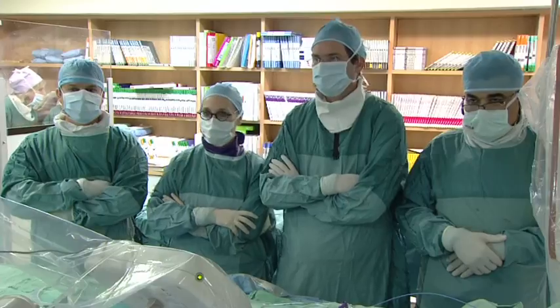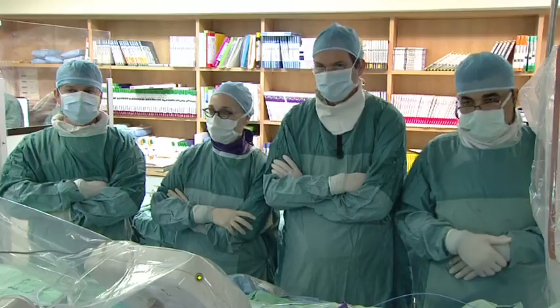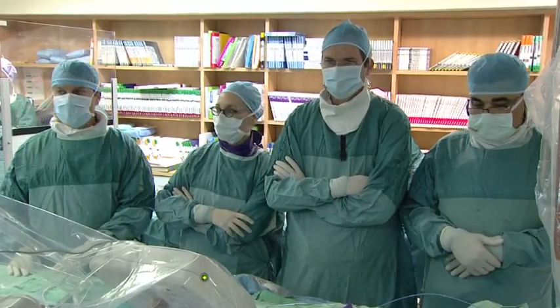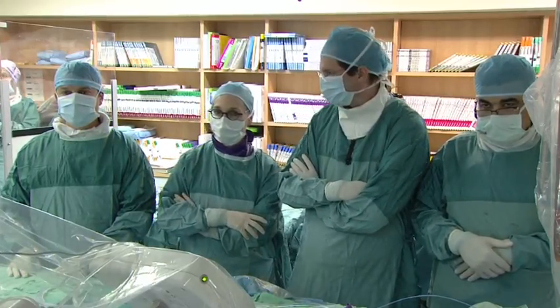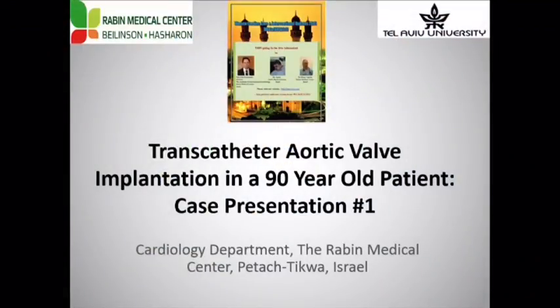The first patient that we would like to present is an elderly patient with critical aortic stenosis, and we are going to present to you how we perform a TAVI case, and I would like to ask Dr. Pearl to present the case. Thank you, Professor Kornowski. So the first case is going to be a transcatheter aortic valve implantation in a 90-year-old female patient.